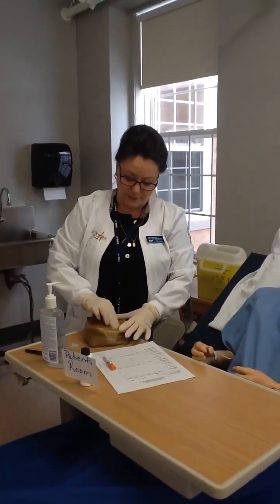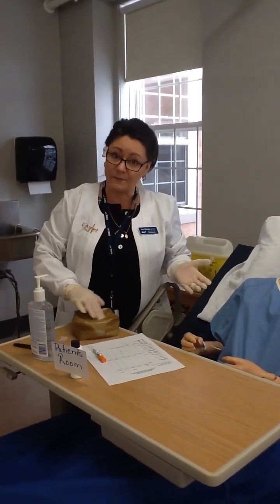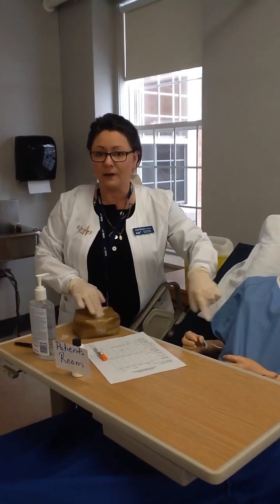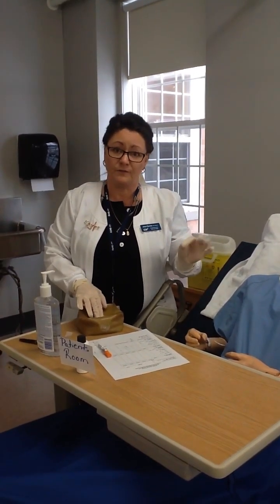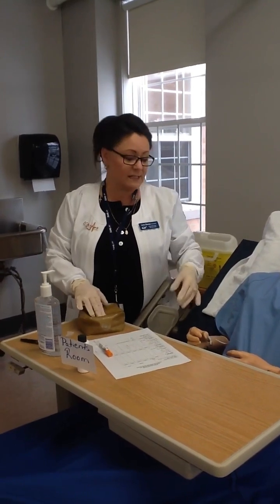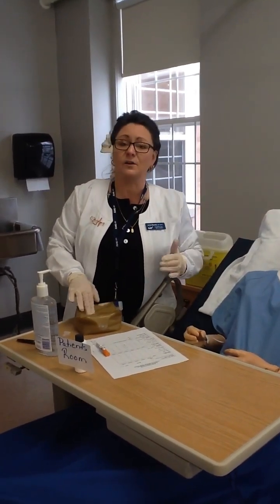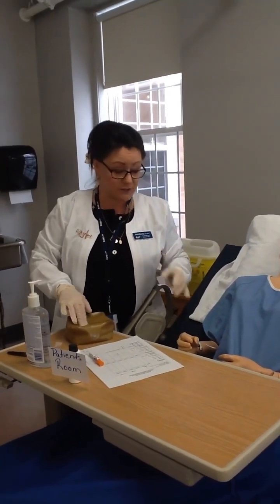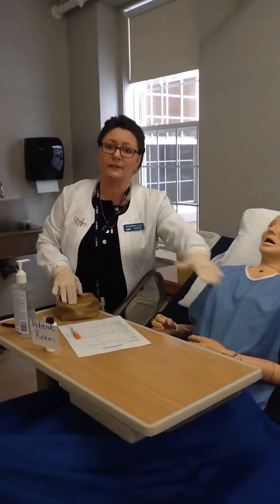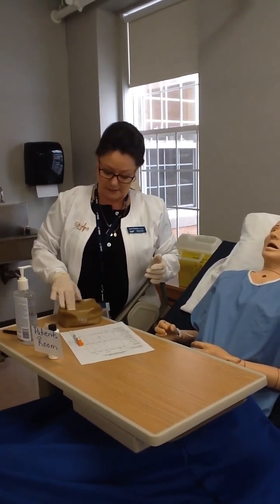And I'm going to swab a big 5 centimeter circle. I could give this in the lateral aspect of the arms, as we discussed. I can give it anywhere in the abdomen, 2.5 centimeters away from the umbilicus. And Perry and Potter 2020 now says that rotating from arm to arm and abdomen to thigh is no longer necessary with insulin injections. We can predominantly rotate around the abdomen 2.5 centimeters away from the umbilicus.